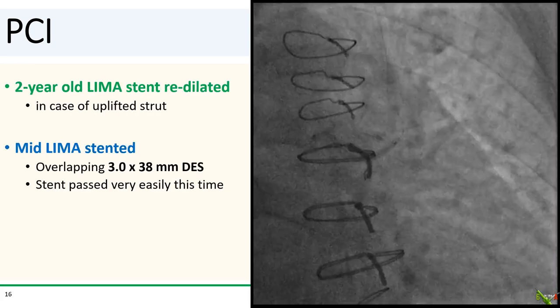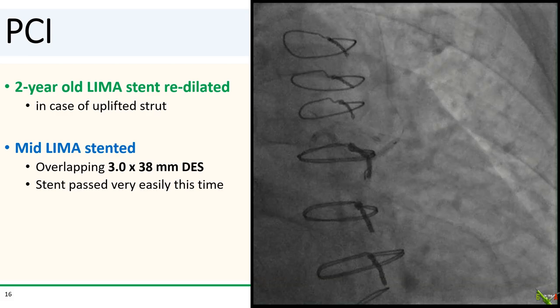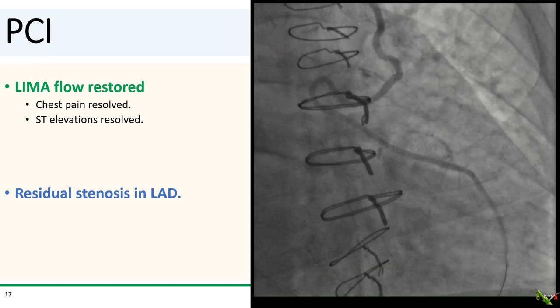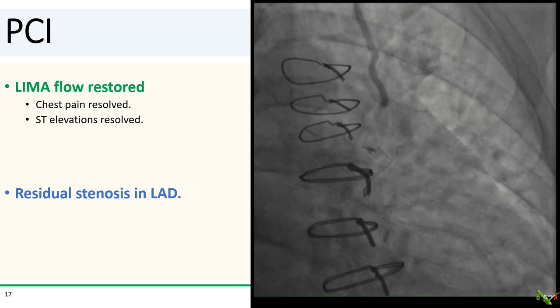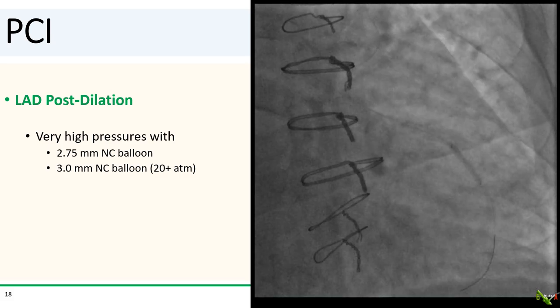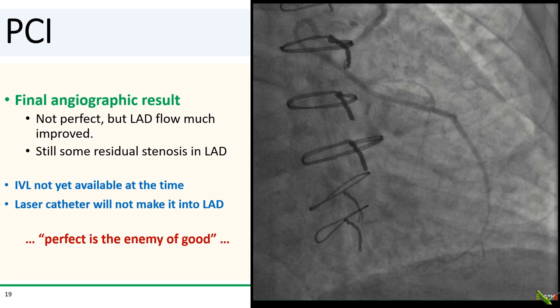We gently redilated the two-year-old LIMA stent in case there was an uplifted stent strut. We then tacked up the dissection in the LIMA with a 3.0 by 38 mm DES, and thankfully, the stent passed very easily this time. Flow in the LIMA was restored, the patient's chest pain resolved, and the ST segments normalized. There was still some residual stenosis in the LAD, so we post-dilated at very high pressures — over 20 atmospheres — with 2.75 and 3.0 mm NC balloons. Here is the final angiographic result: not perfect, there's still some residual stenosis in the LAD, but flow was much improved. We decided to declare victory. Shockwave IVL was not yet available at the time, and there was no way a laser could have made it down into the LAD.